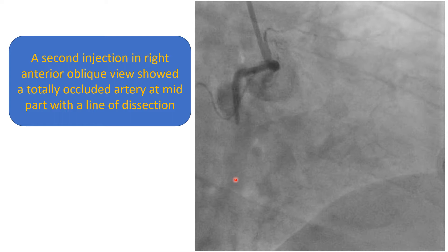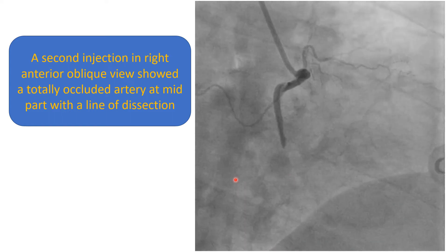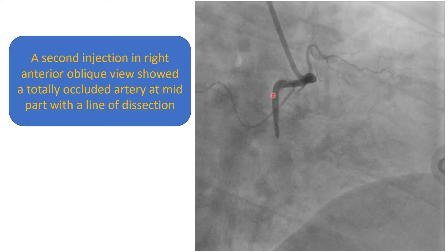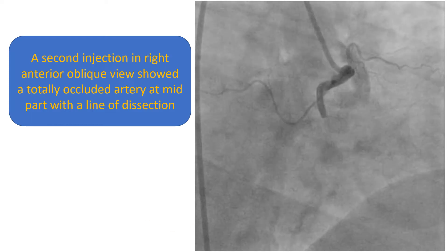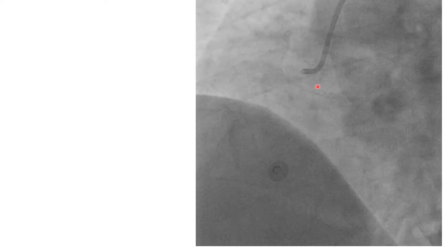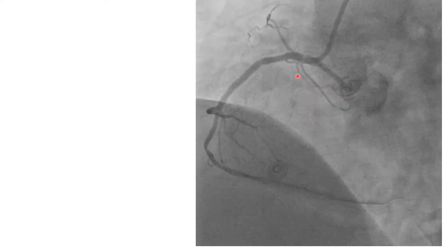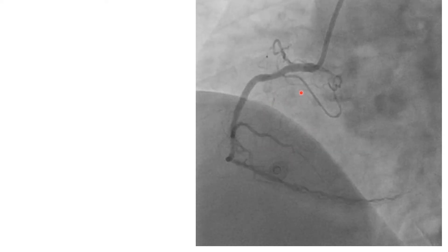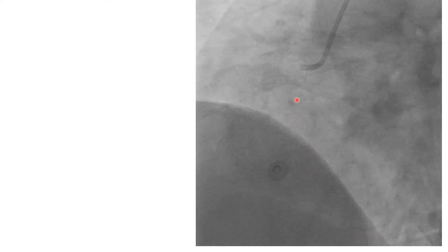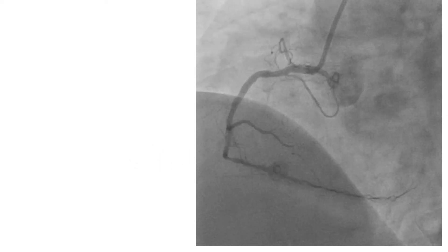A second injection in the right anterior oblique view shows a totally occluded artery at the mid part and we can see a line of dissection. Upon review of the first injection, we can see that there is some haziness at the ostium of the right coronary artery. So probably if that was noticed initially, further injection would not have been done and the dissection would not have progressed.